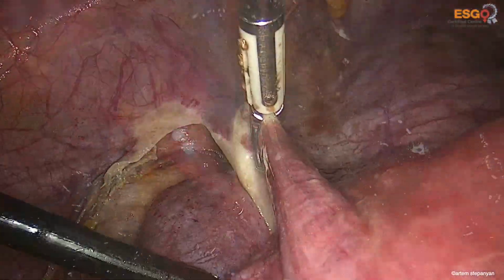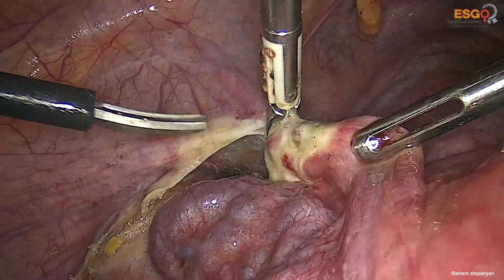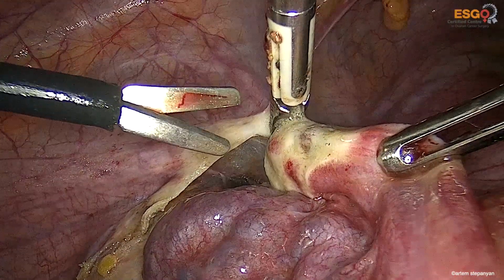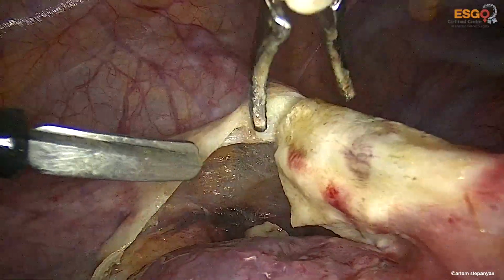And this part of our surgery is more or less similar to total mesorectal excision that is being done for rectal cancer.